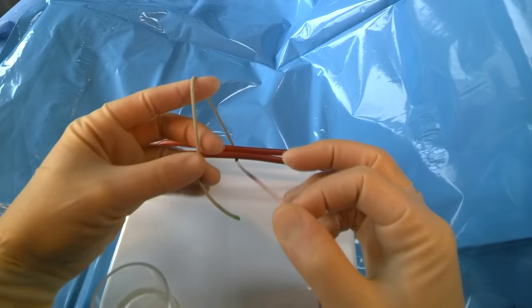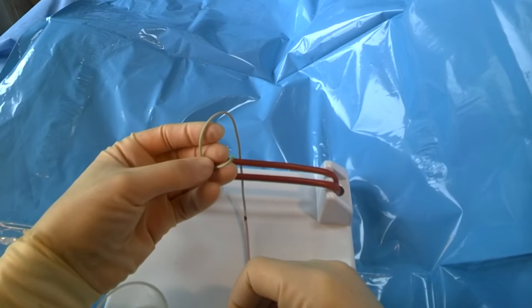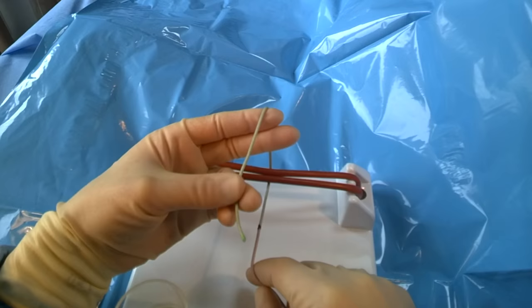What I'm going to do is pick up the short thread which is currently facing up between my thumb and my ring finger, so we're laying it downwards over these two fingers and bringing the short thread up. You can see here.